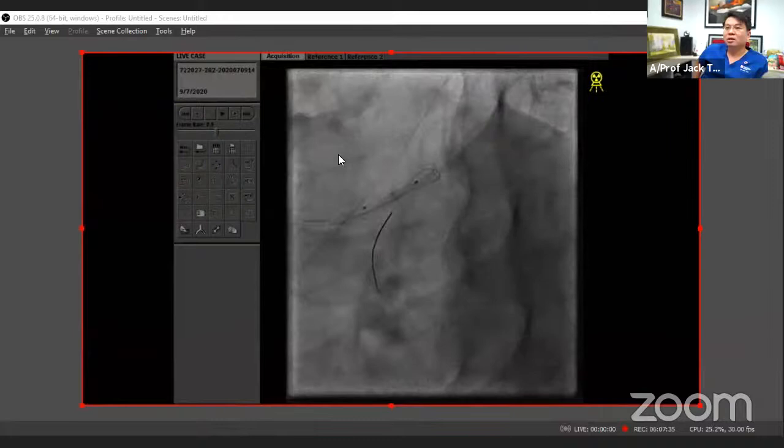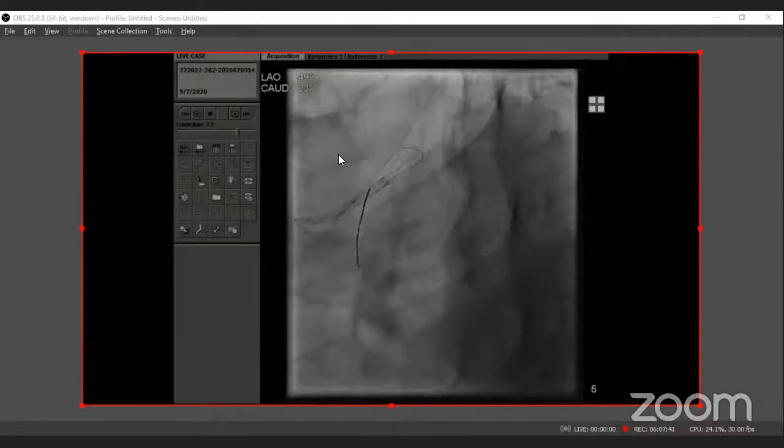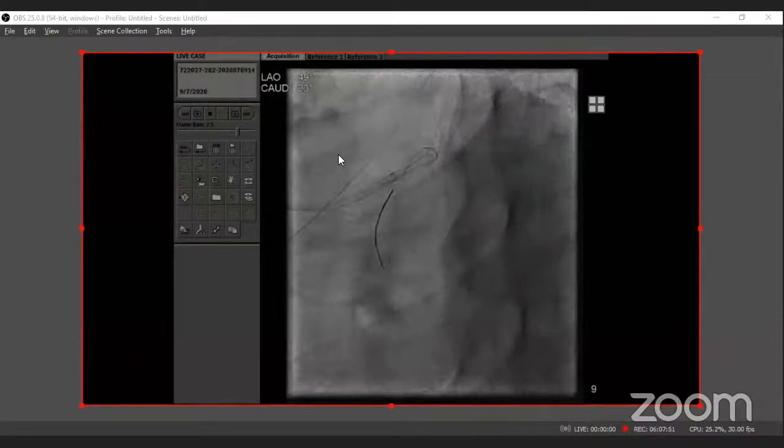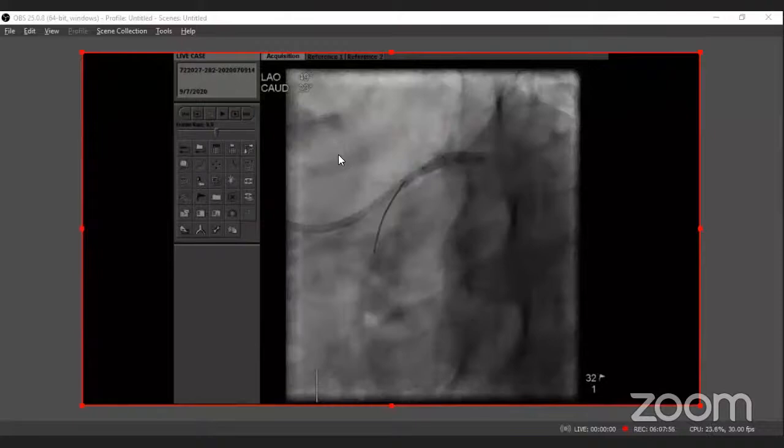Now we're going to do the IVUS, which shows that the vessel is about 4.0 to 4.5. So we're just going to use the 4.0 NC balloon. We use a shorter one because sometimes the stent inside the left main is short, so you don't want to injure the non-stented segment in the left main, and you also don't want to put the two big balloons in the side branch. So we can just dilate near the carina.